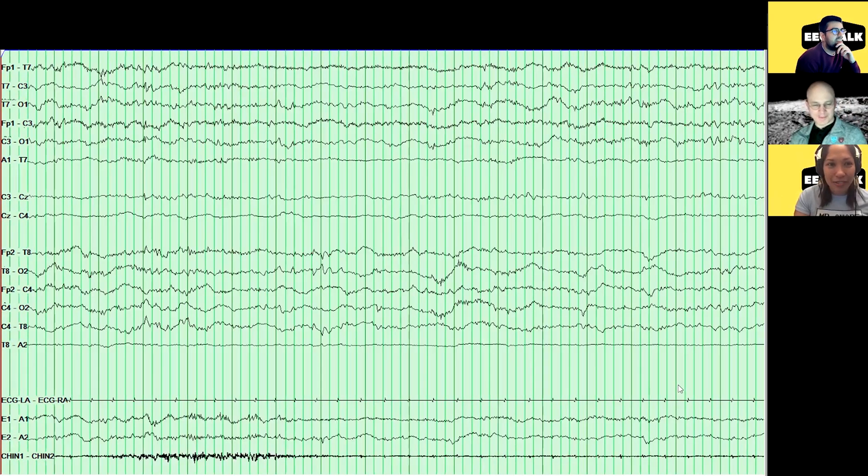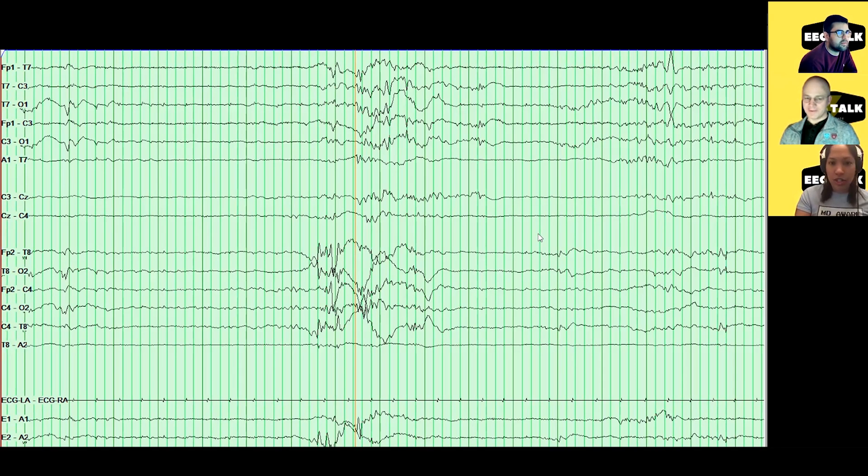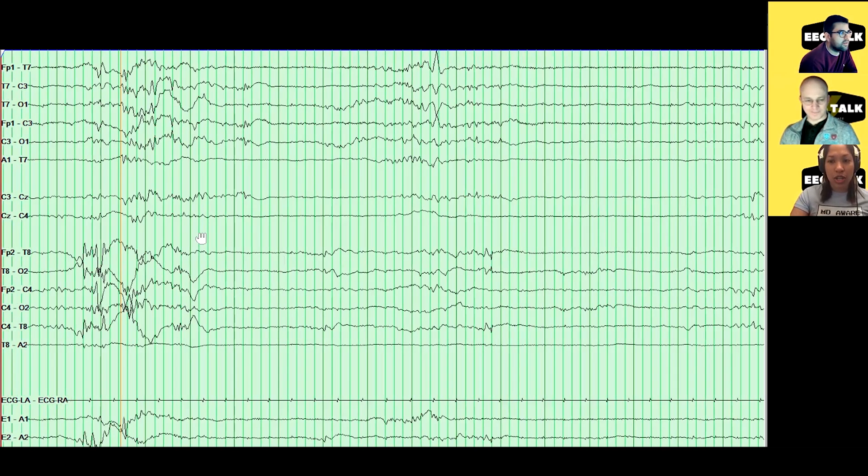Audrey, can we measure and maybe switch to time base so we can see the bursts and then calculate interburst interval? Oh, sure. I'll go back to sleep. Sure. So basically, for example, during sleep, you'll have a burst here, you'll have a burst here, and each of these bars is one second. So you could roughly count one, two, three, four, five, six, seven, eight, nine, maybe nine seconds in a burst interval here. I think I may have seen some longer ones as well.